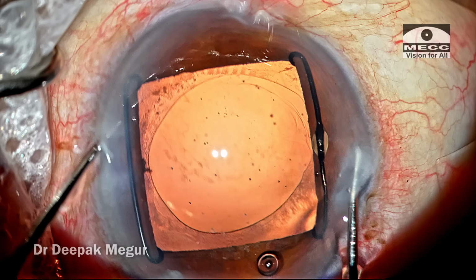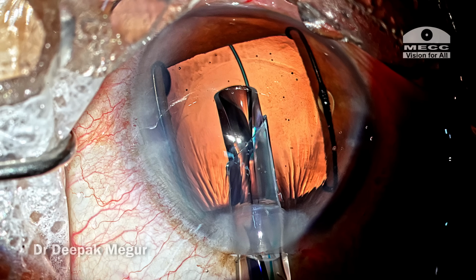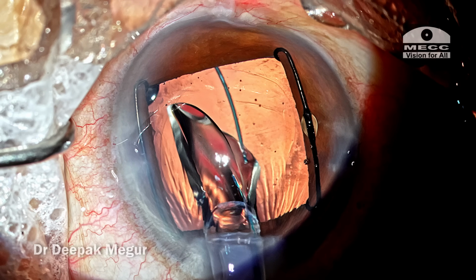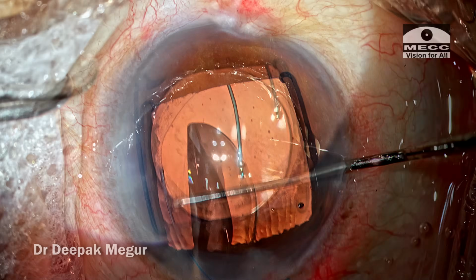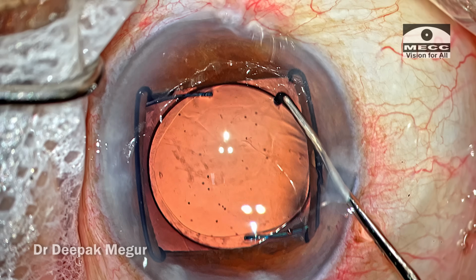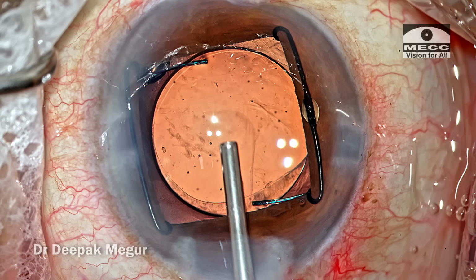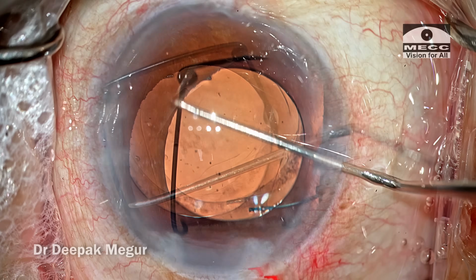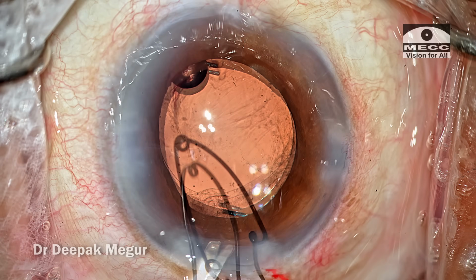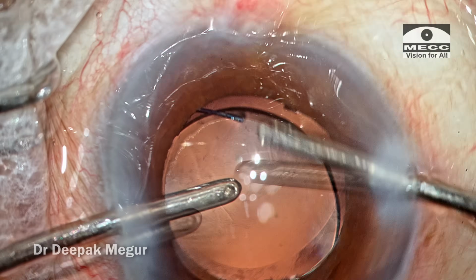Now is the time to place the lens. OVD is placed in front of the anterior capsule to create some space. An appropriately powered multi-piece lens is placed in the sulcus. First the leading haptic goes in, the trailing haptic is then dialed in. Time to remove the pupil expansion device. All the 4 notches are disengaged. The pupil expansion device is explanted out. Now is the time to remove the OVD both in front and behind the lens.